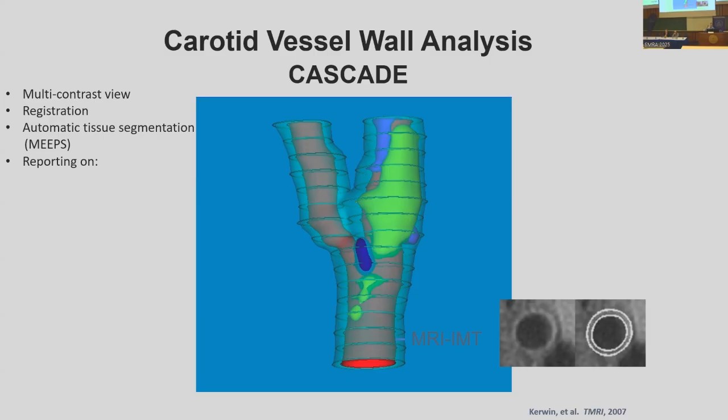And what is the history of this atherosclerosis development in human? In fact, really did not exist. There were histology studies, but there were really no information based on humans. You can actually see this is what early lesion, later lesion is. So when this technique is being developed, we're also learning the nature of the disease. And I think that actually is a very different aspect of imaging.